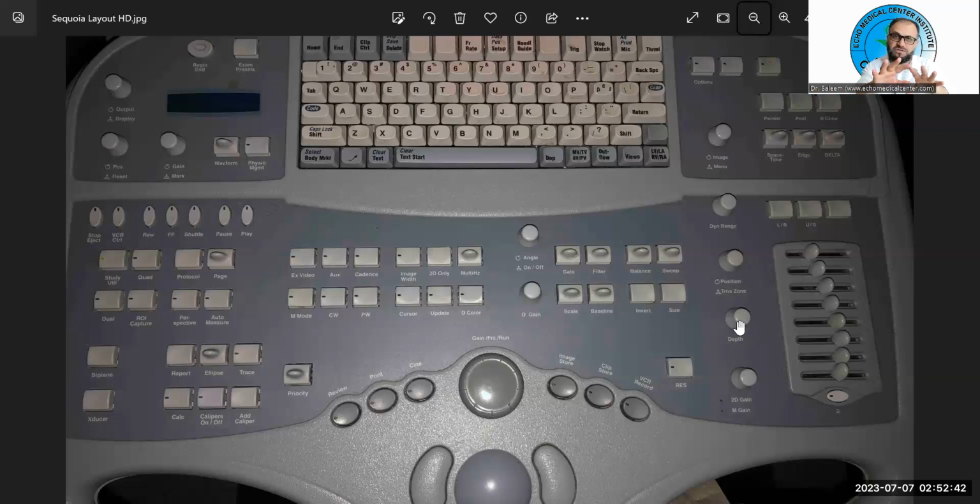If you're looking at a structure, for example, let me give you an example. You're looking at thyroid tissue. You can see the whole thyroid tissue in 3 centimeters. So make sure not to make the depth more than 4 centimeters. That 1 centimeter has to be just extra to see the neighborhood. If there are any pathologies or any abnormality, we can catch it. So that is the depth.